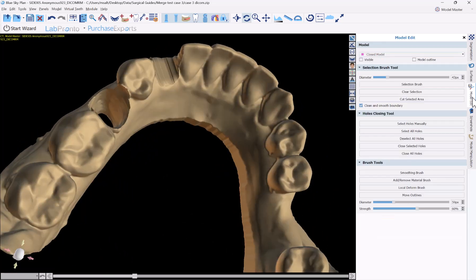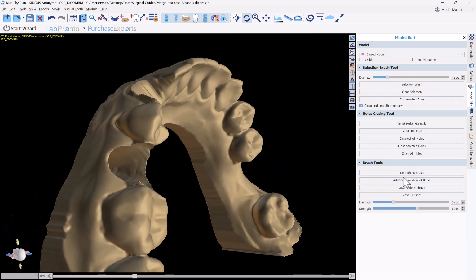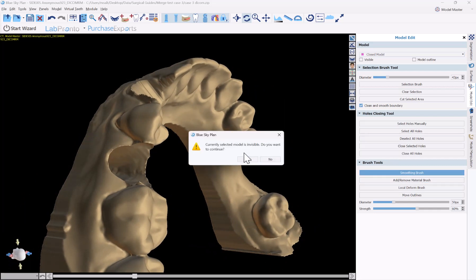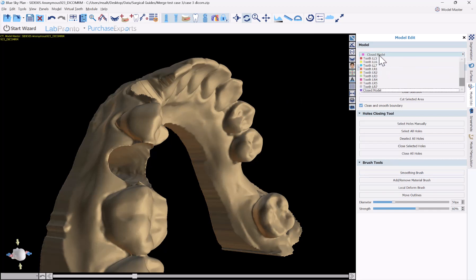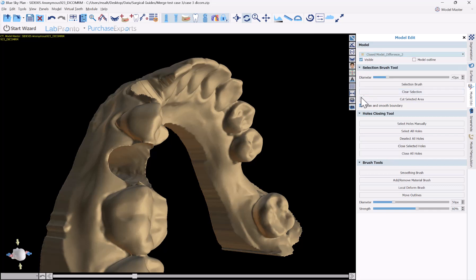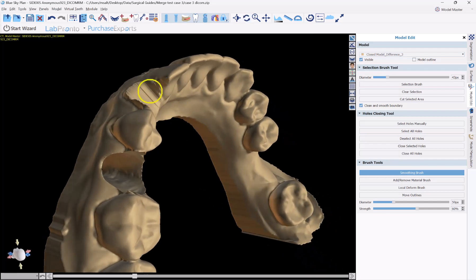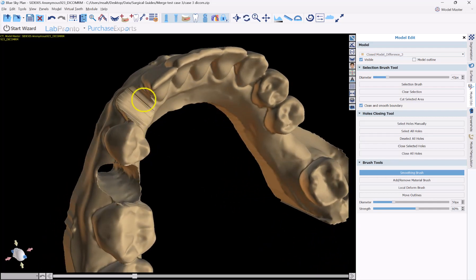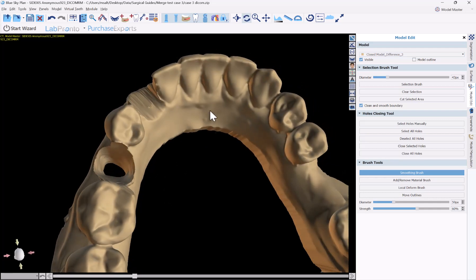We have tools available. If you go to model editing, we have a smoothing brush. If you have a rough area you want to smooth out, just click smoothing brush. It's important to confirm you have the correct model selected — the warning says the currently selected model is invisible, meaning I had one model visible and another selected. Always confirm you're operating and cutting on the correct model. I'll click smoothing brush, hold down shift, use the left mouse button, and smooth out the relevant area.